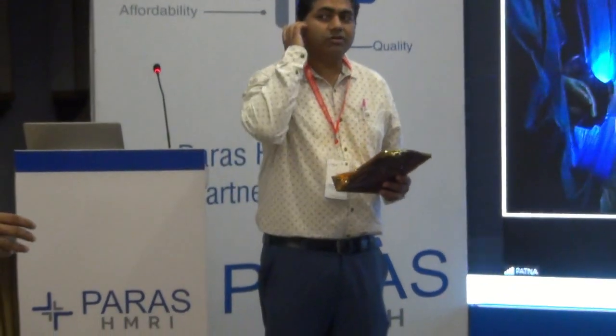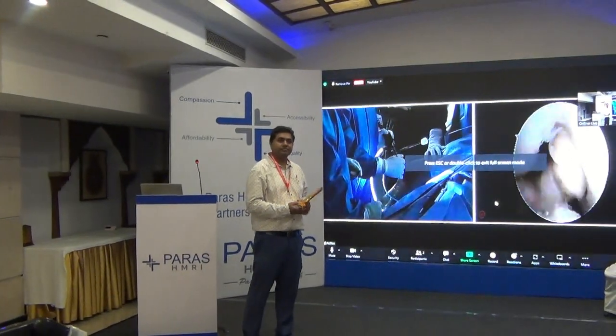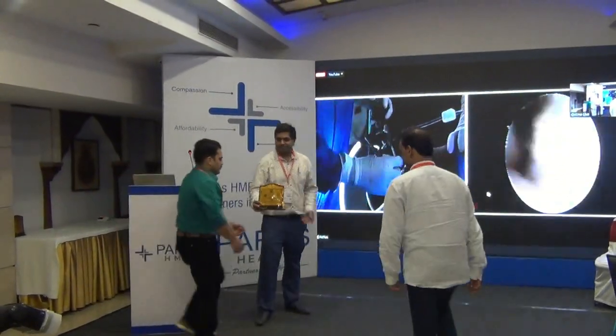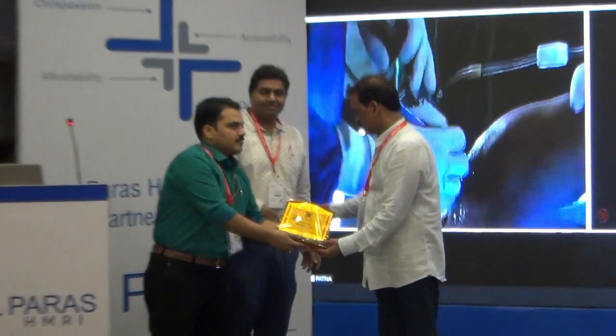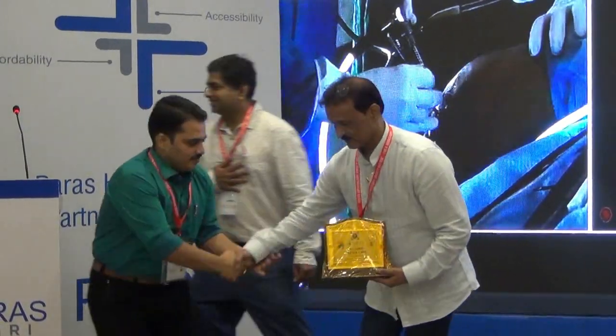Coming on to the intercondylar area, we have cleaned this area. This is the footprint of the ACL, you can see very well. This is the footprint on the tibial side, and again on the femoral side, I'll show you the footprint when we make these tunnels. Okay. Coming to the lateral side, can I have the figure of 4 position?